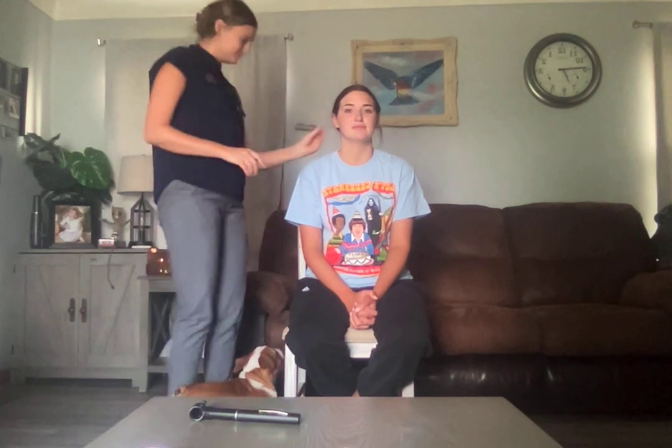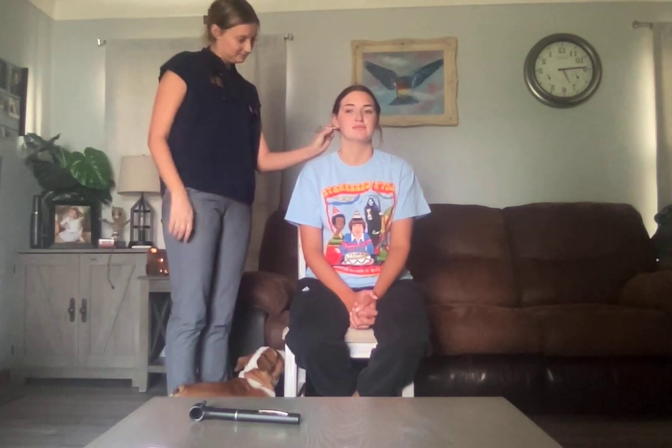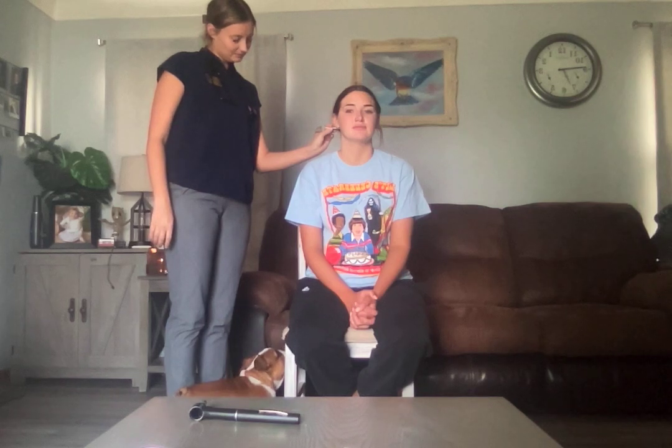I'm going to use my tuning fork. So to start, I'm going to place this on the top of your head. I want you to tell me if you hear anything, okay? Yeah. All right. And next I'm going to place it behind your ear and I want you to tell me when you stop hearing the noise, okay? Can you hear it again? Yep. Good. We'll try the other side, okay? Okay. How about now? Yep.